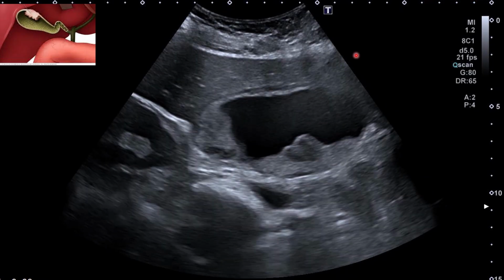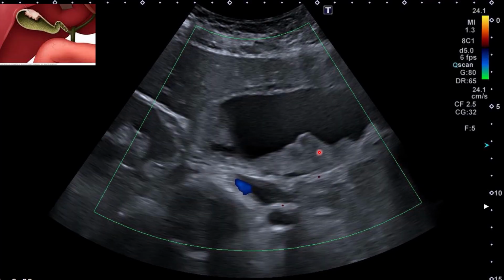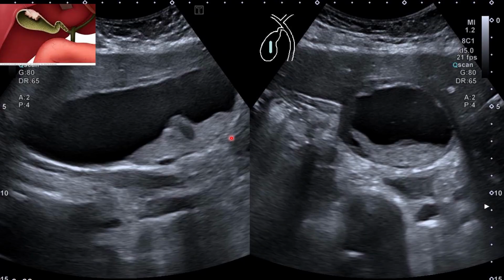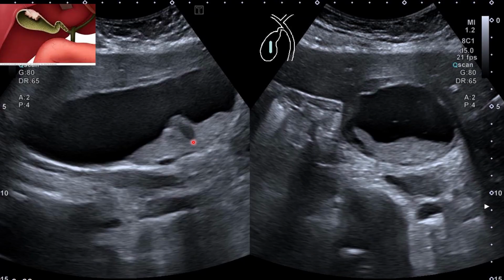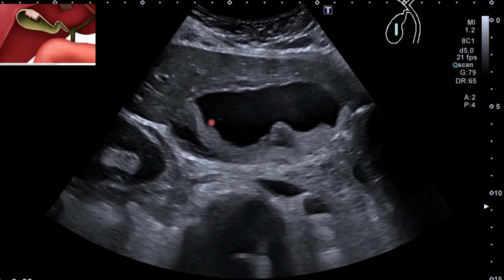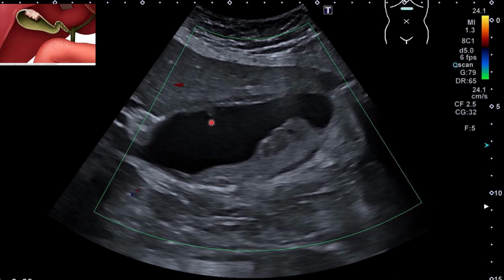Is it benign or is it cancer? Because if you see here, it can also have some microcalcifications that can cause the shadow that you are seeing there. Because directly below this, that's where we've got a shadow. So this area there is casting a shadow. Help me, guys, to narrow down the diagnosis.